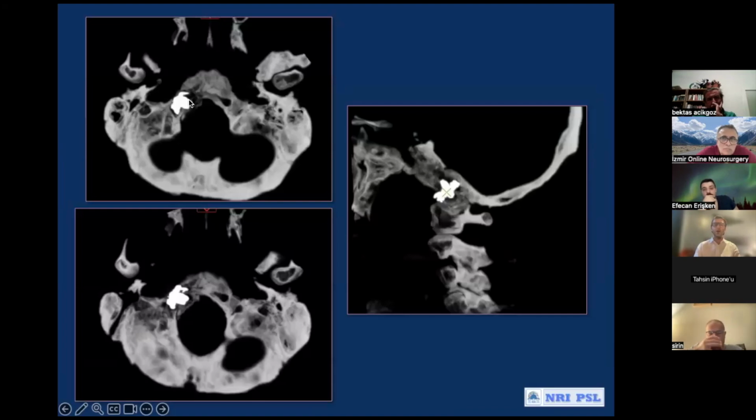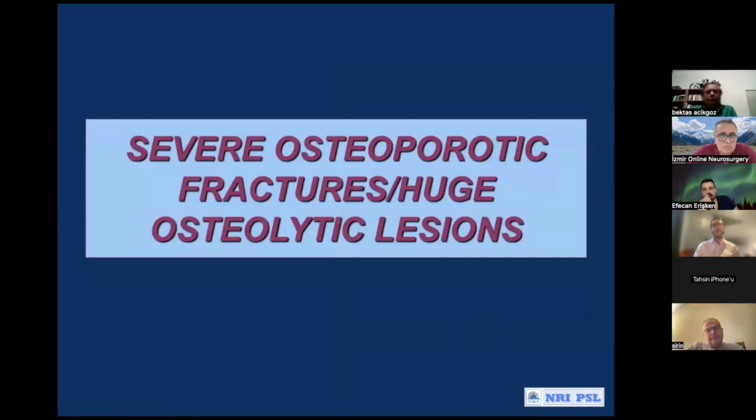And you can see on the CT scan a good filling of the lesion with the bone cement. And the patient had a very significant improvement of his pain. He had proton therapy on this lesion also, but the cementoplasty helped to decrease the symptomatic pain.